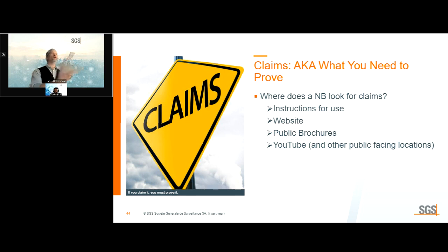So where do we go looking for your claims? Where do we go looking for your benefit statements? The answer is the instructions for use, the website, public brochures, YouTube, and public-facing locations.